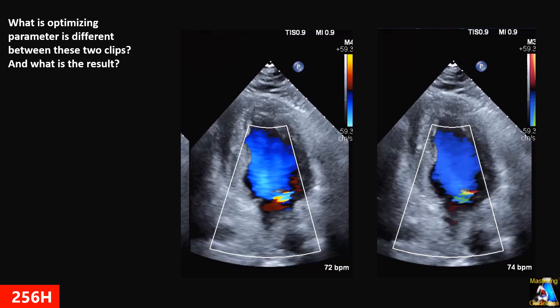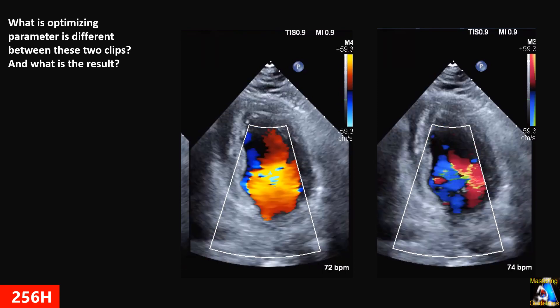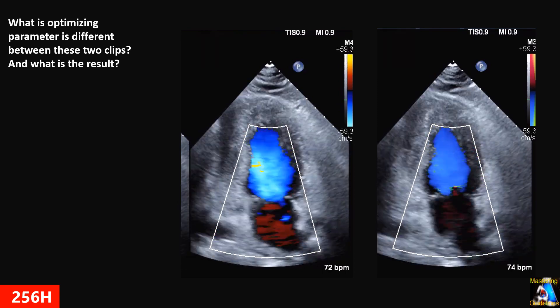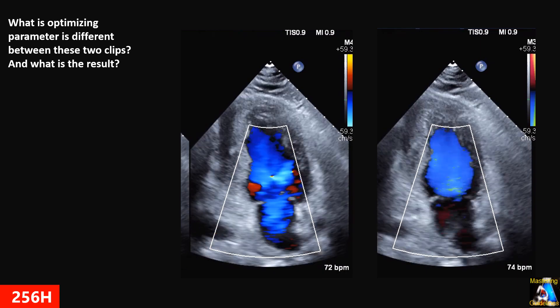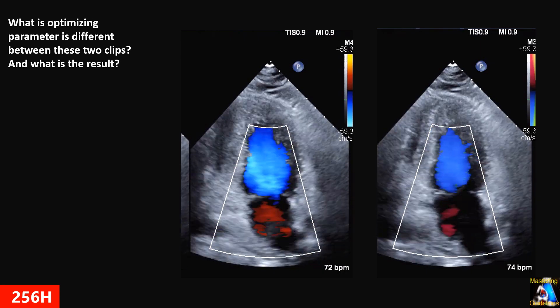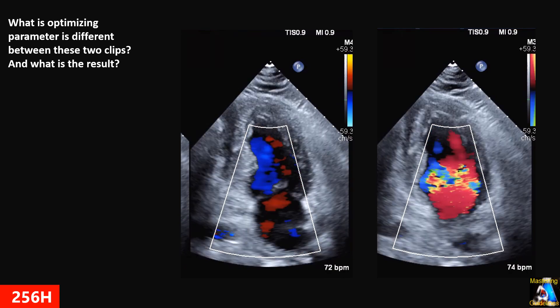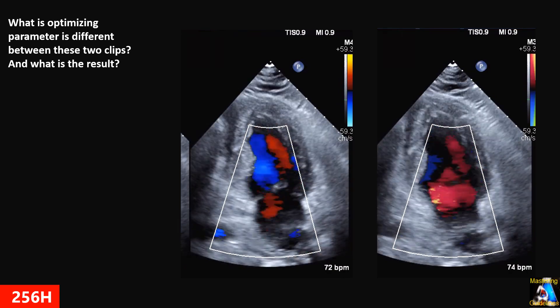Here you have the same view with a different setup. What is different between those color Doppler setups, what do you call it, and when or why do we use it?